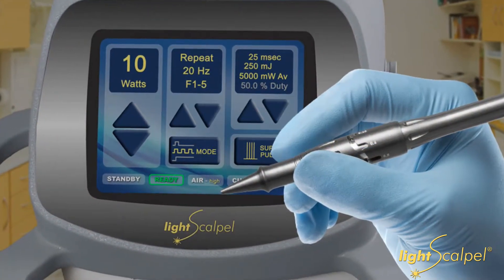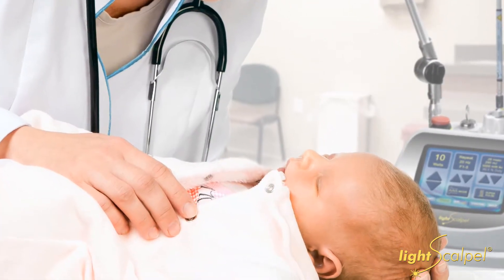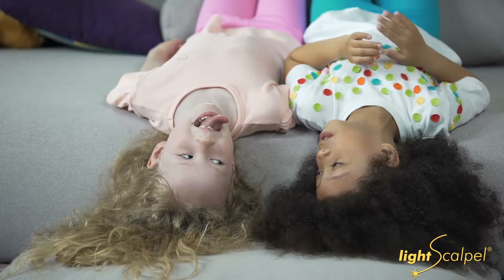I'm using the LightScalpel CO2 laser. I tell people you can release ties with anything, but our LightScalpel lets us release the ties completely, safely, and easily. We get great results with less risk of reattachment. The babies do better. I've had patients where I released the first kid with scissors, the second with the diode laser, and the third with the LightScalpel — and even the parents and the kids can see the difference. It's pretty fabulous, and I love what I do.